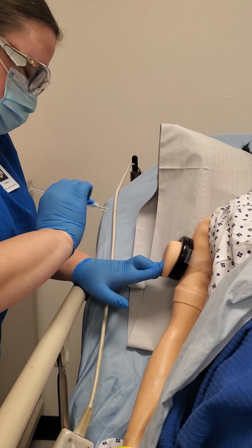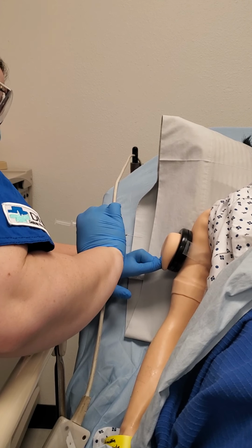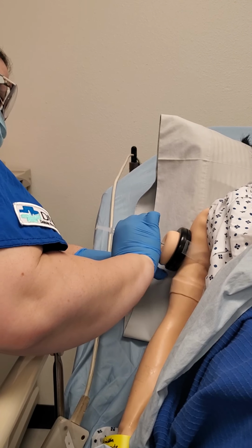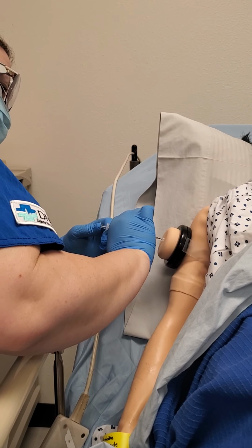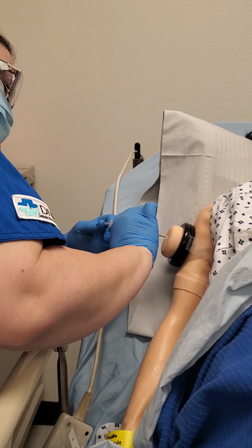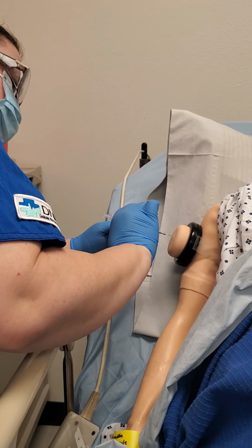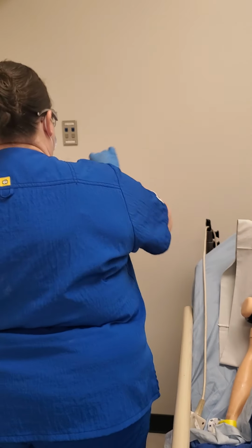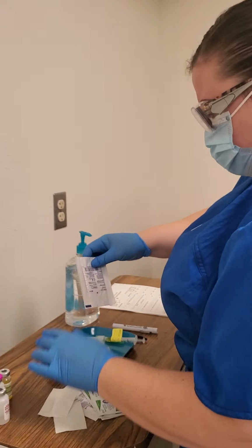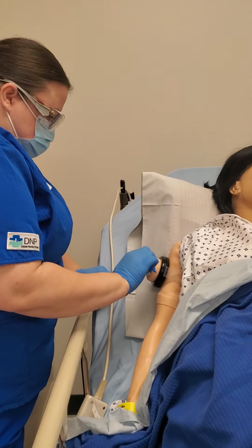You ready, Shirley? 1, 2, 3. Okay, and then I'm just gonna kind of hold a gauze pad on there.